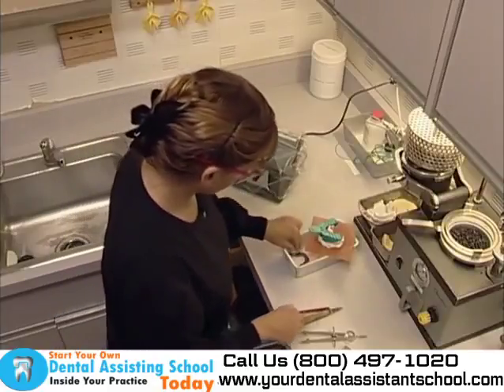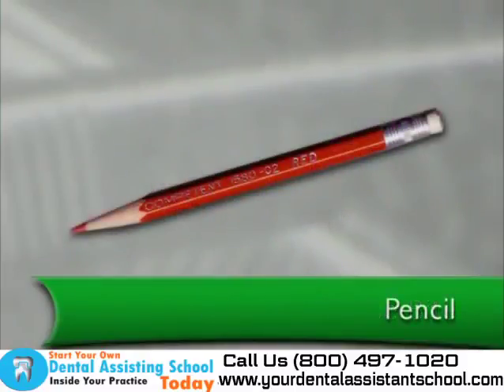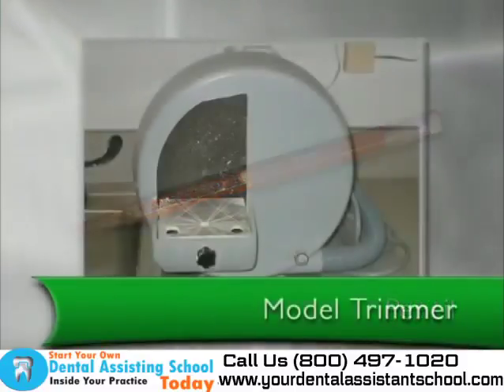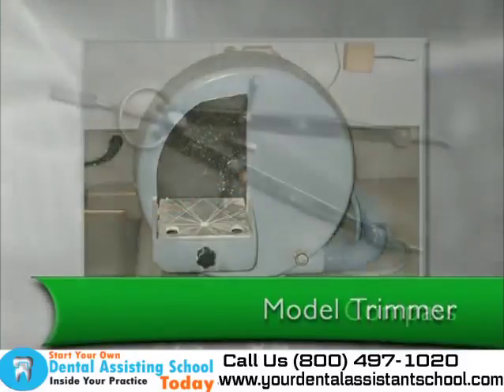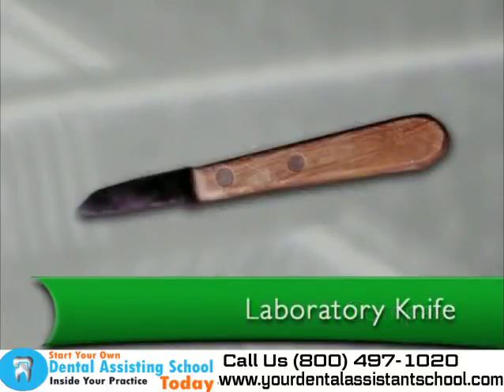The assistant should have a wax or a silicone bite to reference the occlusion, a pencil to draw a line on the model, a model trimmer to grind and trim away the gypsum, a compass protractor to properly trim a model, specific angles predetermined by the dentist should be created, and a laboratory knife for trimming and cutting the model material.